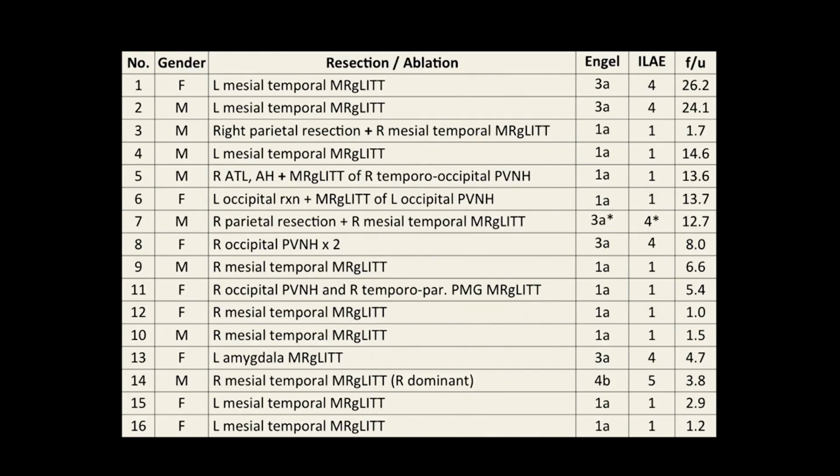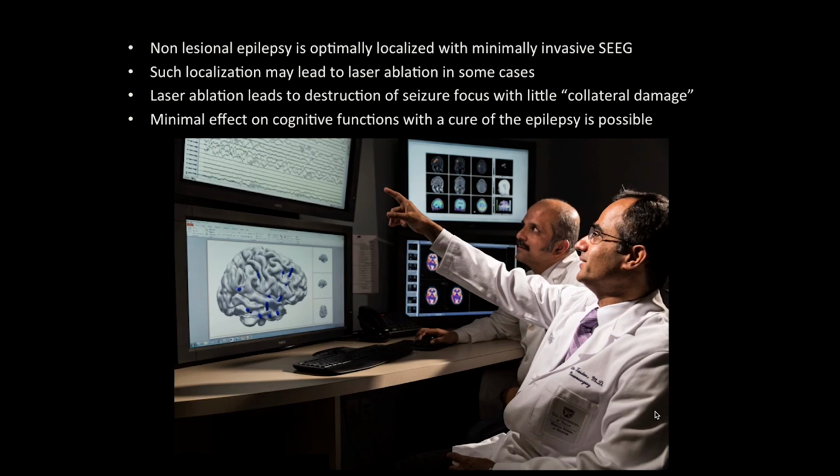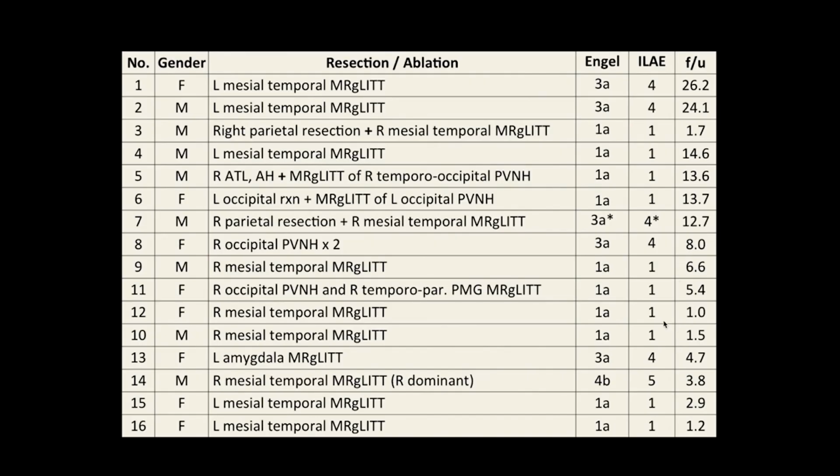And this is the outcome in those patients that we have treated this way. The smaller this number, the better the outcome. And I'm going to draw your attention to this score here, which shows a number 1 in more than half of these patients. And remember that many of these patients are really hard to localize, are really difficult to identify the seizure focus on.